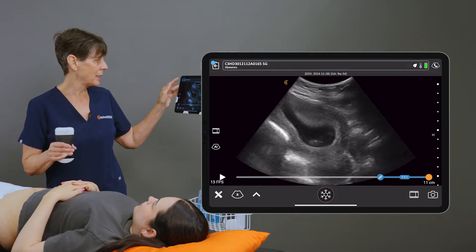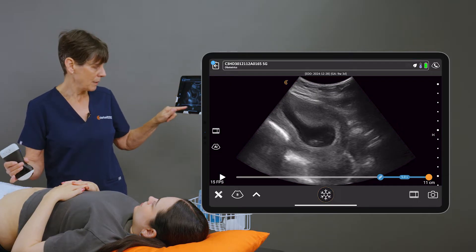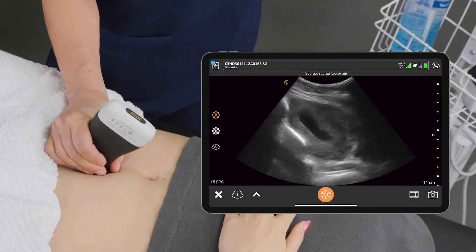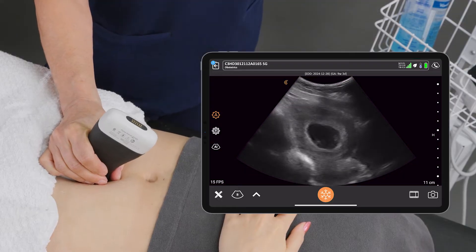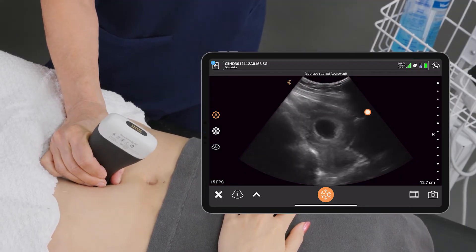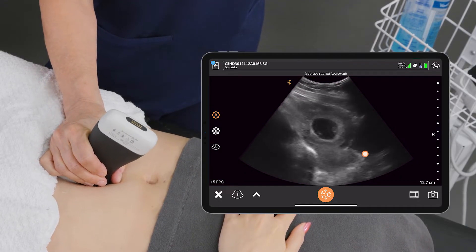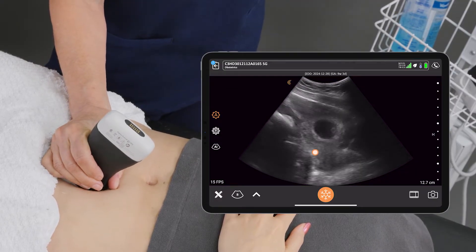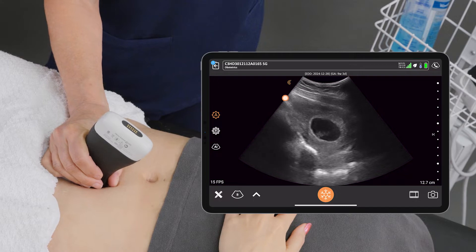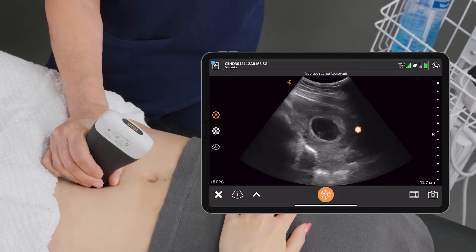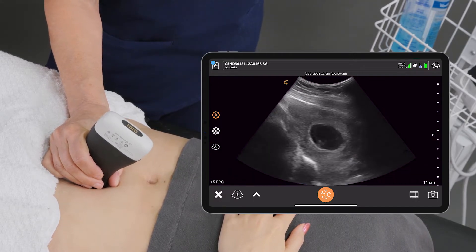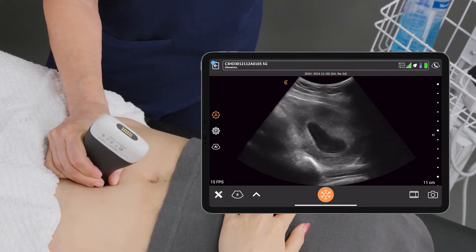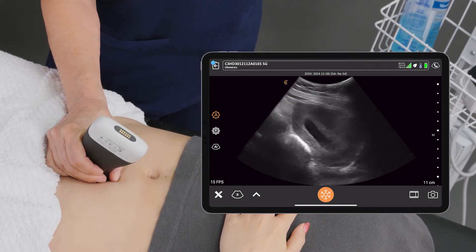I'm using the C3 scanner in the obstetric setup, and I'm going to place my scanner in the sagittal plane for starters. Now my model's bladder isn't very full, but we can still see the vagina and cervix here, and I'm midline on the uterus, and we can indeed see that the pregnancy is intrauterine. I'm just going to scan back and forth to get an overall look at the uterus.